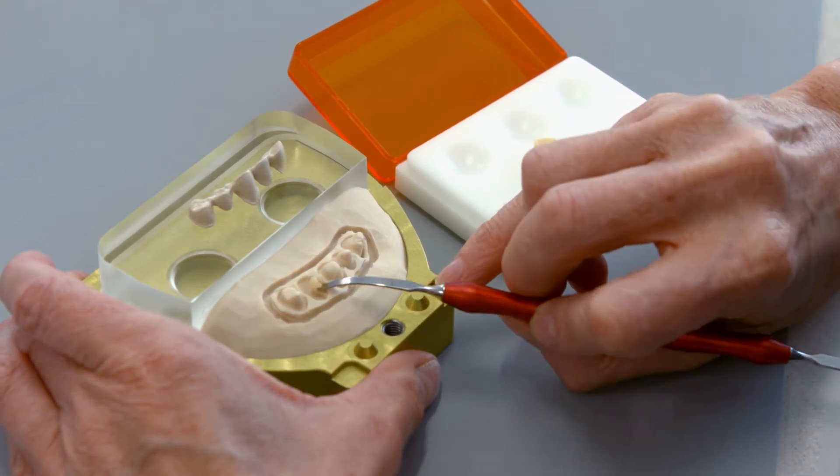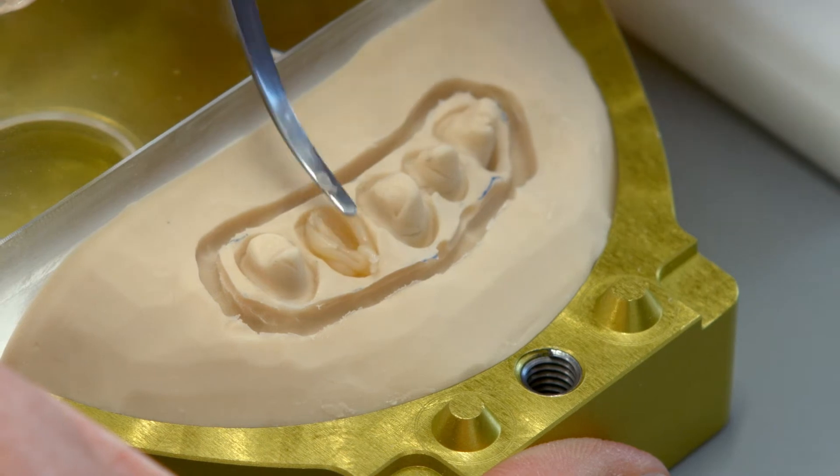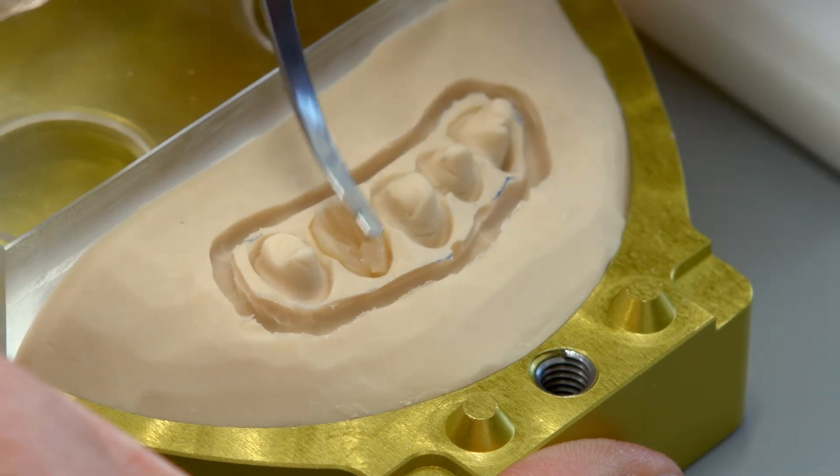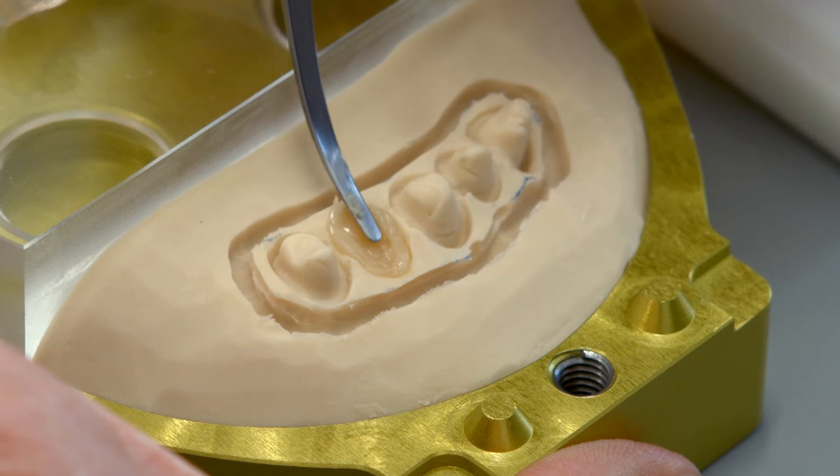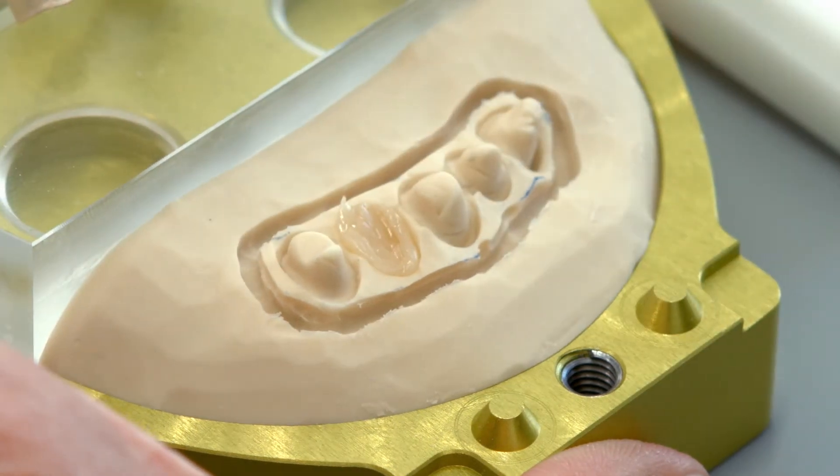Bridge pontics should be adequately filled with composite resin before they are placed. Dispense the resin without creating any bubbles or voids and distribute it evenly.